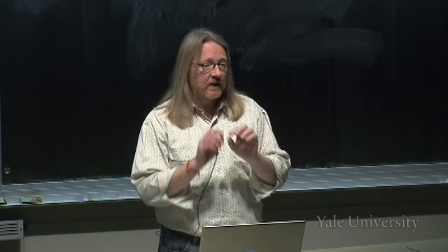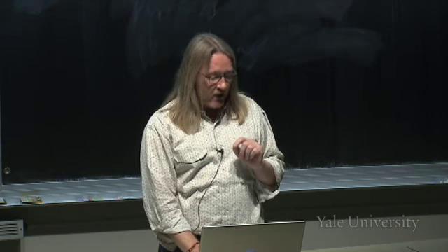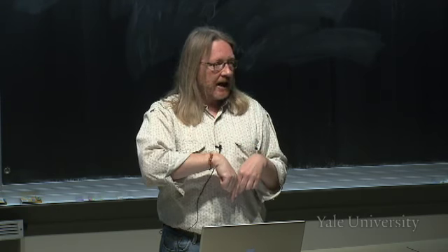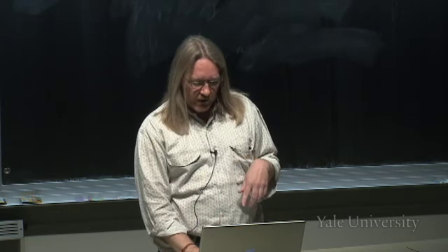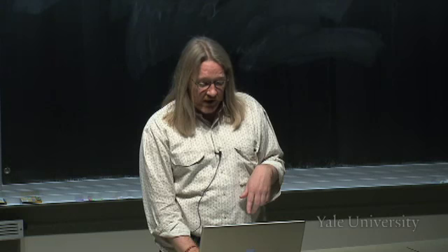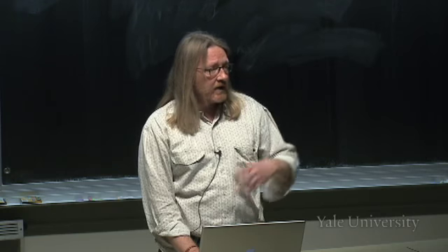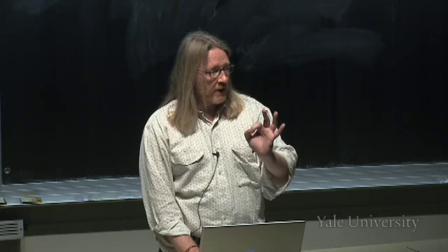So this endoscope is designed so that a patient will swallow it. This end will go down in their mouth, past their vocal cords, through their esophagus, into the stomach, and then out of the stomach into the duodenum, or the first part of the small intestine. And that's what's shown here. This is the valve that's leading from the stomach into the duodenum. And you can see what the lining of the small intestine and the stomach looks like. This has been a very important diagnostic approach for using light to image the lining of the stomach.